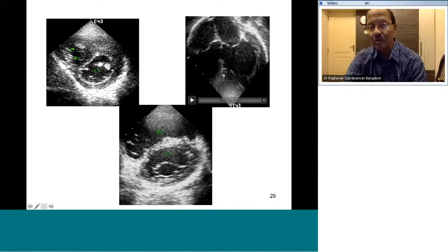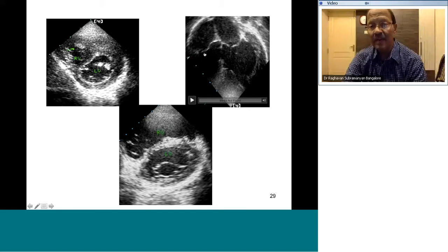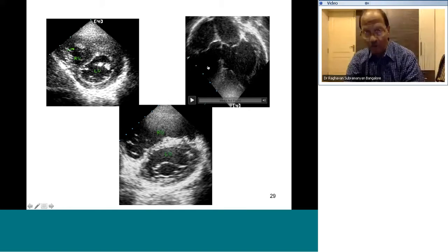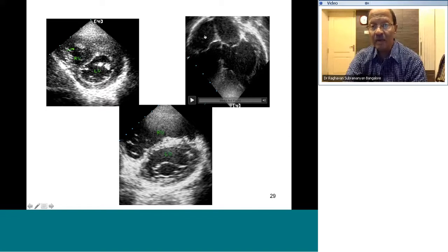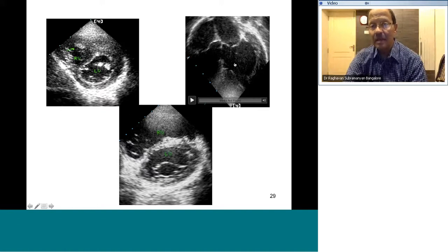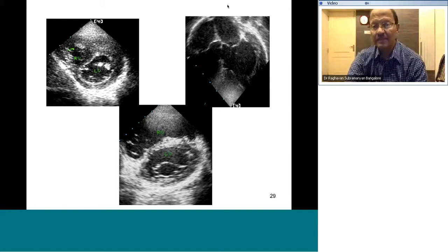From the features — smooth ventricle, higher mitral valve offset, reticulated opposite ventricle, and lower tricuspid valve — we can determine that in this example the right ventricle is on the left side and the left ventricle on the right side. Therefore this is L-loop. Whatever atrium opens into the smooth ventricle on the right side is connecting to the LV, and whatever atrium opens into the trabeculated ventricle on the left side is connecting to the RV.